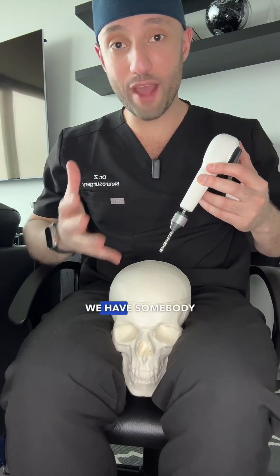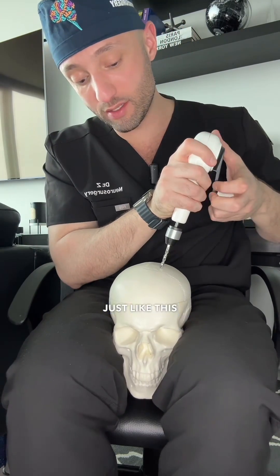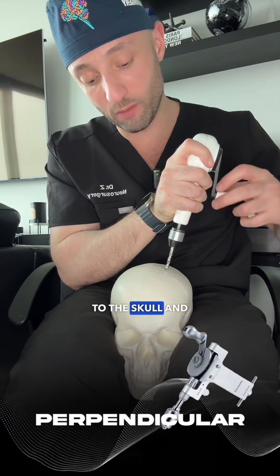After we make our incision, we have somebody hold the head steady and then we apply the drill just like this and apply a little bit of force. We make sure that it's perpendicular to the skull and then we begin drilling.